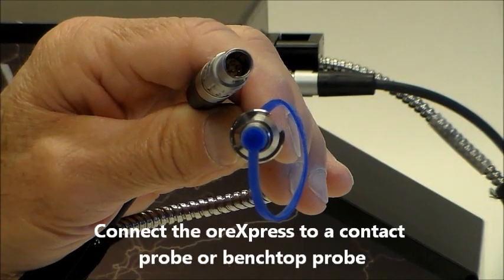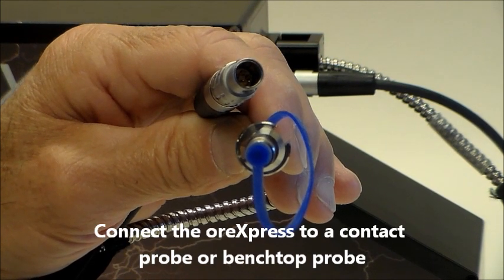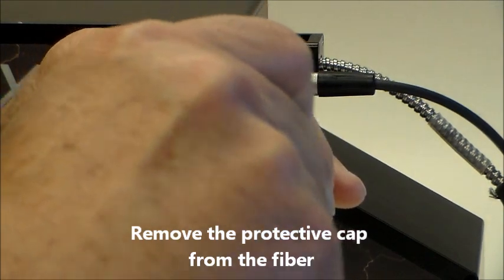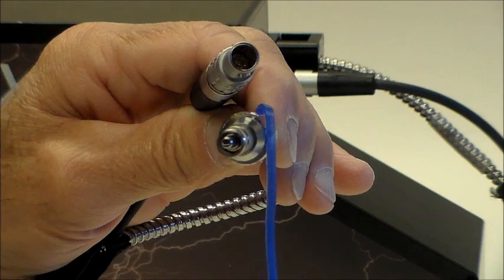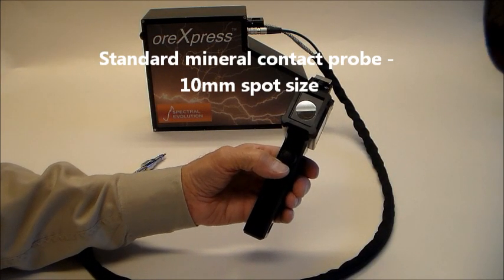Attaching a contact probe or desktop probe requires connecting the power supply cable and fiber-optic cable from the ORExpress. Remove the blue protective fiber cover. Here we are connecting the standard 10-millimeter spot-sized contact probe.